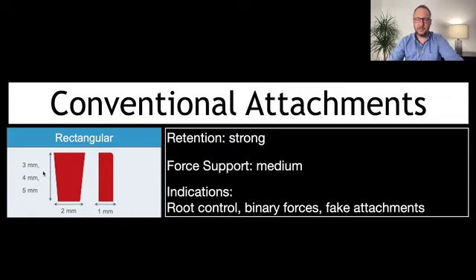But my opinion, and here you are discussing with me, is that for retention mostly, the more the better, the bigger the better, okay? I know patients don't like it, but if we really want to improve predictability, we cannot leave a tooth that we are moving without attachment, only for inclinations probably, but this is another topic, okay?